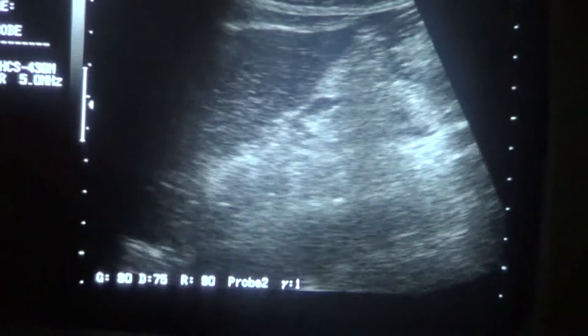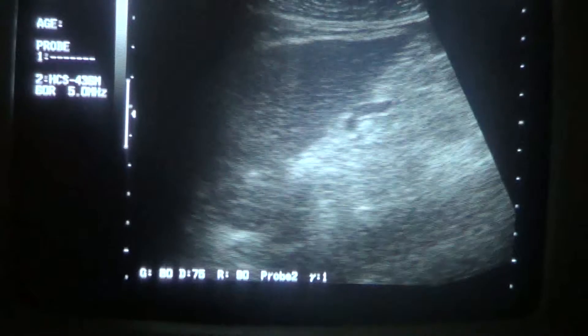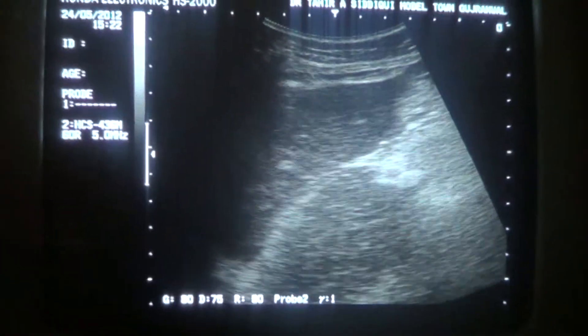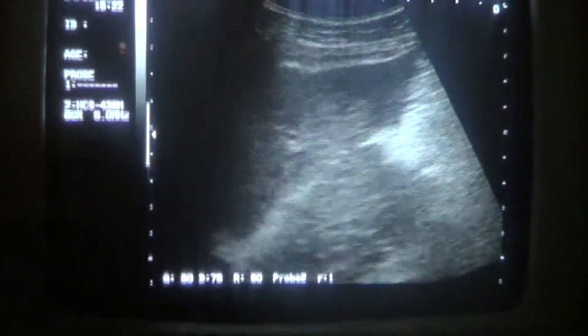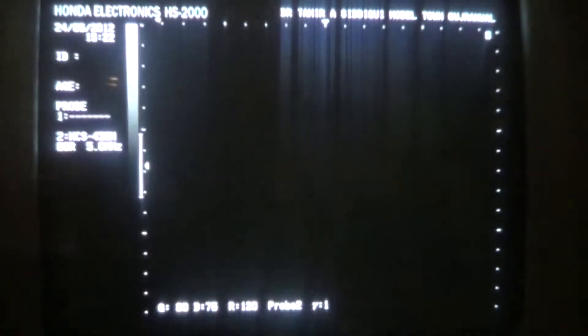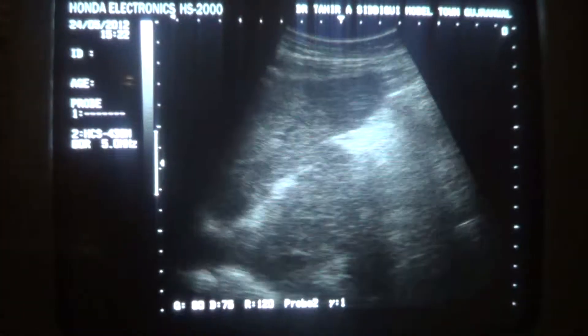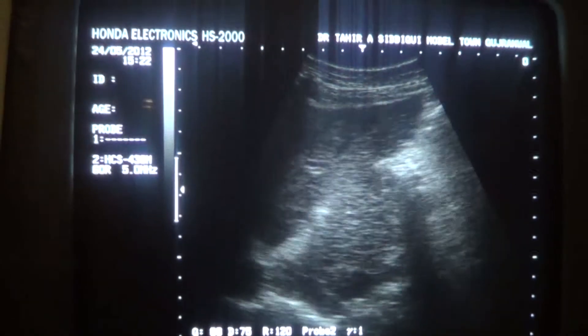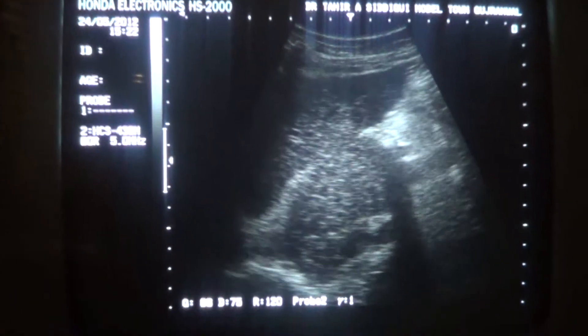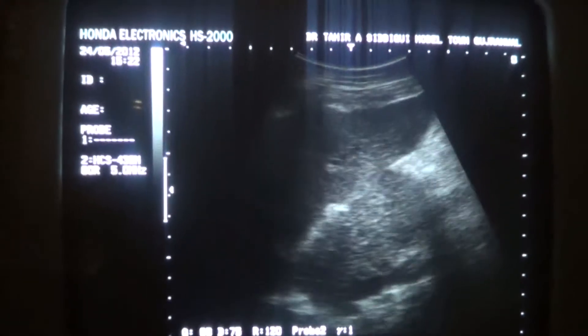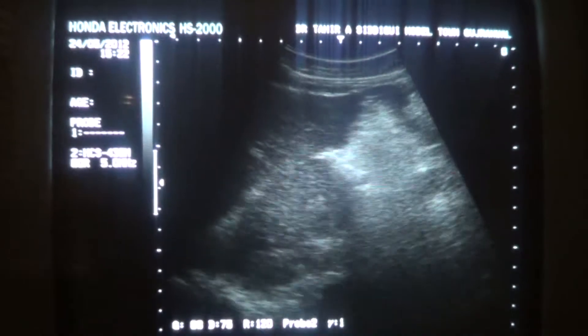This is the longitudinal section of the right and left lobe of the liver. And see the caudate lobe of the liver — this is segment one. Now the caudate lobe shows hyperplasia.